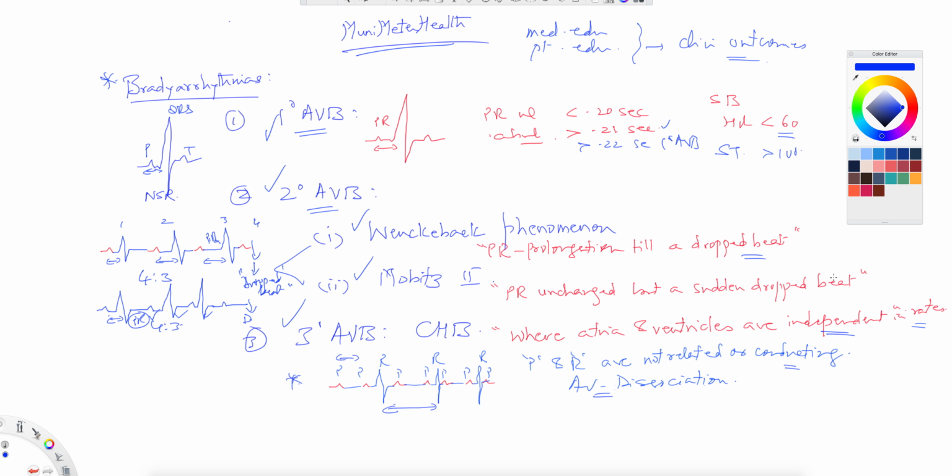Now this is very, very serious, because you don't have any warning whatsoever. It's considered very serious, and in fact this pause can continue and the patient can pass out. Mobitz II, again, is beyond the scope of our video discussion here because we are just discussing the rhythm strips. But the treatment plan here would most likely require a pacemaker, just so that you know.